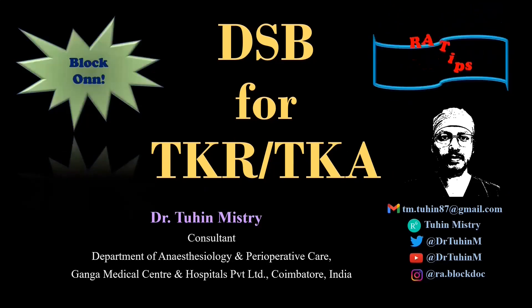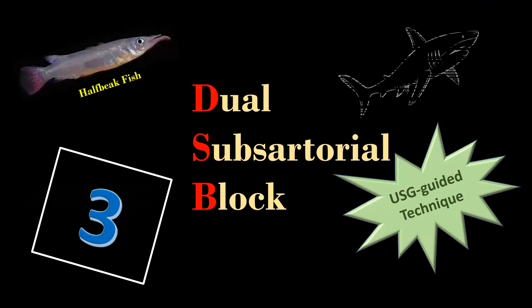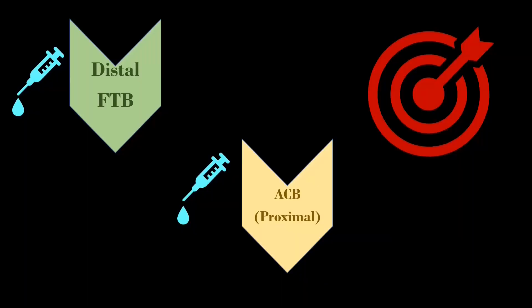Hello friends, welcome back. In this video I am going to demonstrate the ultrasound-guided dual sub-sartorial block, or DSB, based on the sign of three, the half beak pattern, and the shark head pattern. As the name suggests, DSB combines two sub-sartorial blocks: the distal femoral triangle block and the adductor canal block.